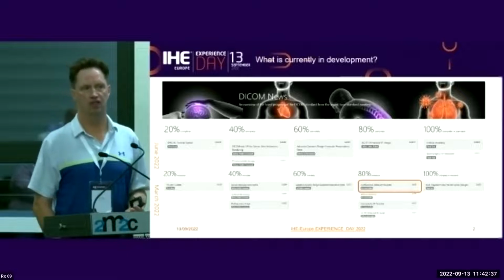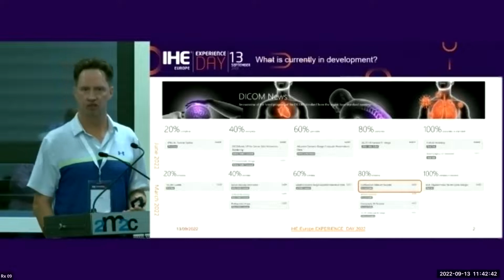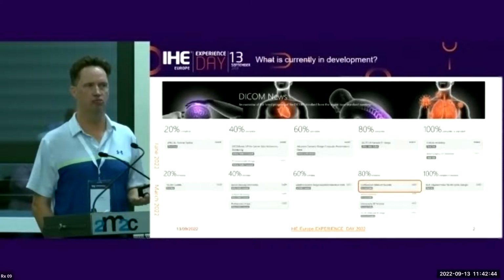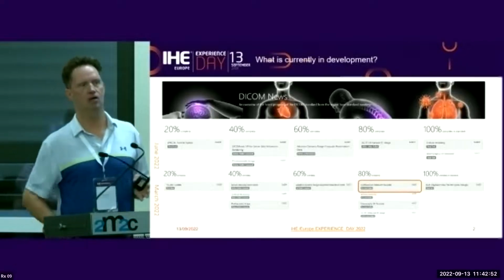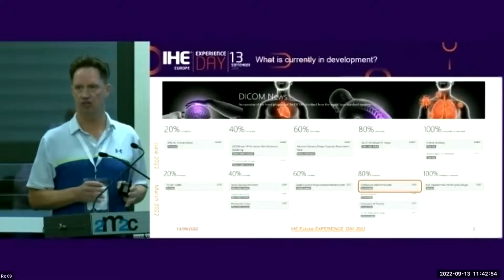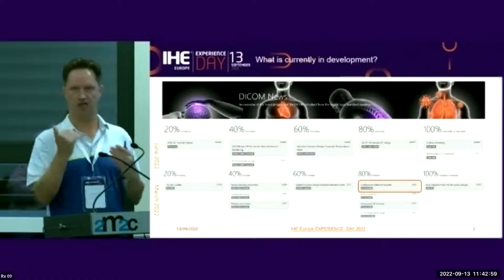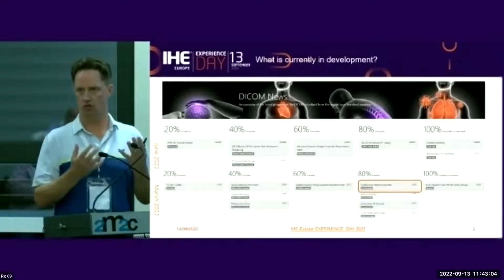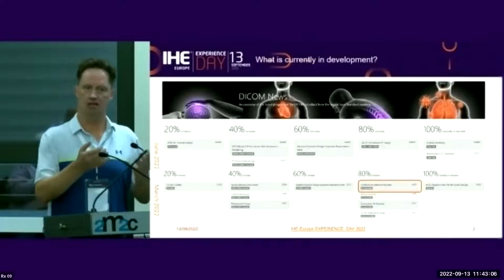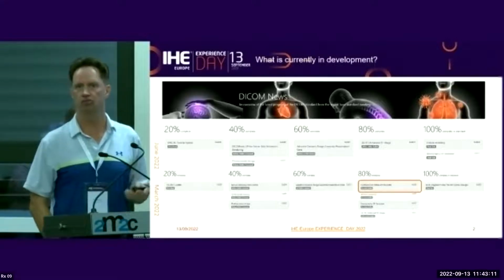Another part is the conformance statement. So within the DICOM standard, every vendor, every type of equipment has to deliver a conformance statement. How does this machine conform to the DICOM standard? And this has been updated, so it's now much more table-based. So it's much easier to compare different equipment from different vendors. You can just compare the tables, but also it's much more machine readable, so you can extract information and do testing or verification and so on from the conformance statement.